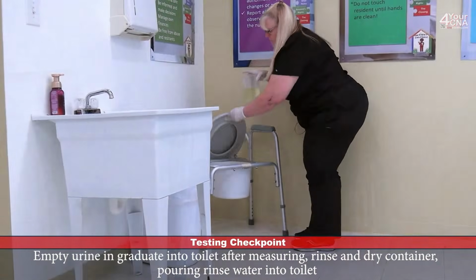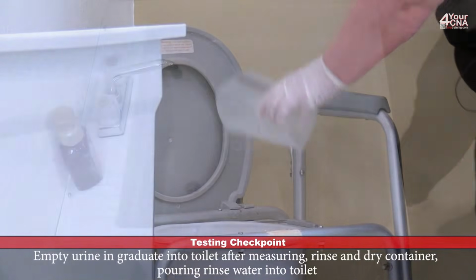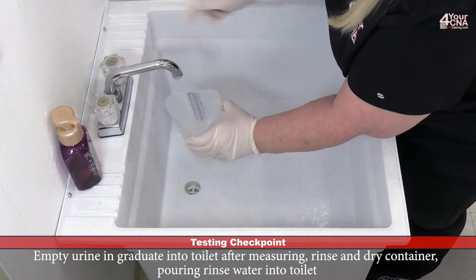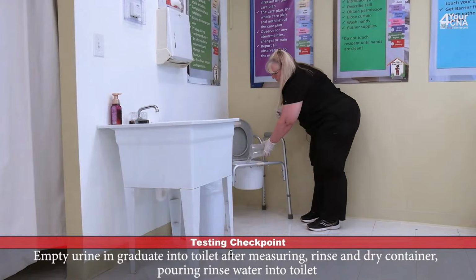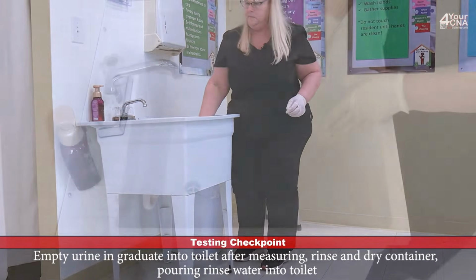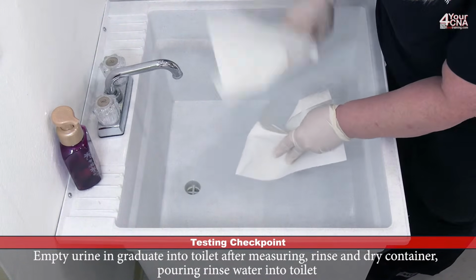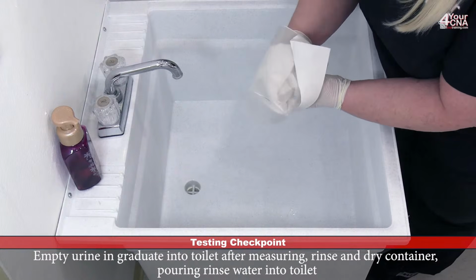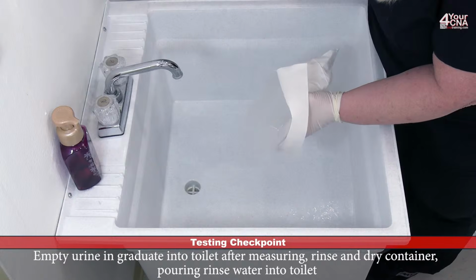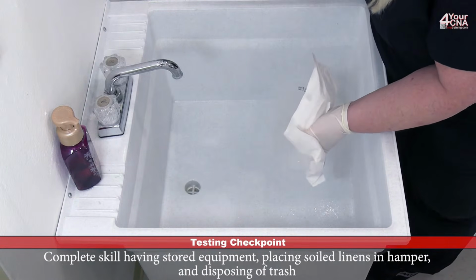Open the lid and the seat and dispose of the urine into the bedside commode. I'll rinse the cup and dispose of the rinse water into the bedside commode as well. We'll close that, set the graduate container down in the sink, and disinfect it per facility policy. I'll pick it up with a paper towel, dry the inside with a paper towel, throw that away, dry the outside with a paper towel, throw that away, and one more for the drawer.